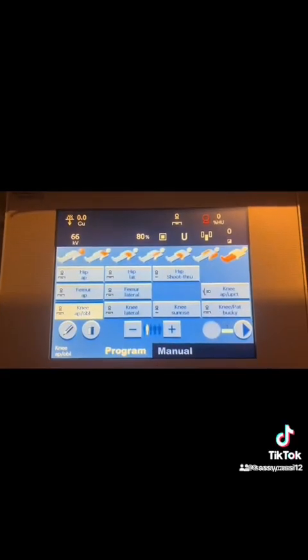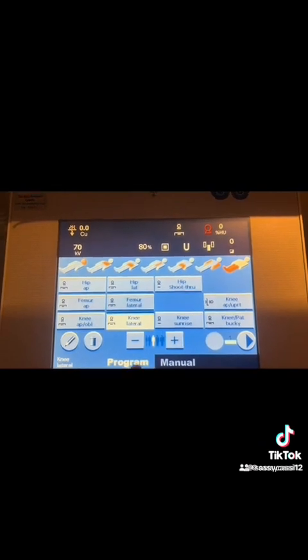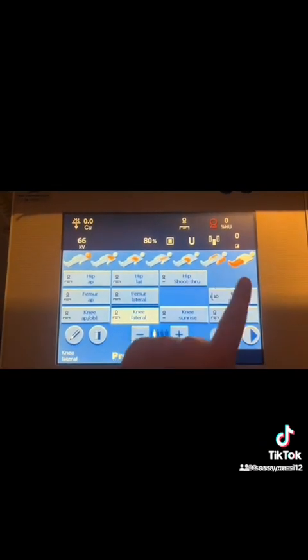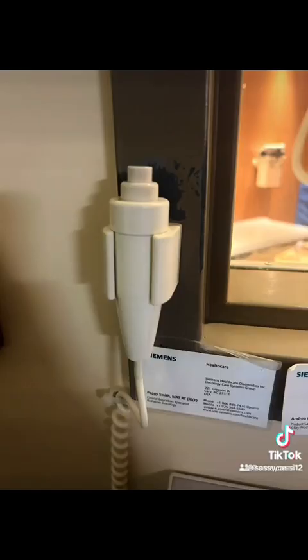So now I go back to the x-ray panel and select lateral knee, and then I will select her body habitus again. And since we are using AEC, we will be using the center chamber. There are no breathing instructions, I just informed Shelby to hold still. The exposure factors for this lateral knee will be about 60 to 70 kVp and 7 to 10 mAs.